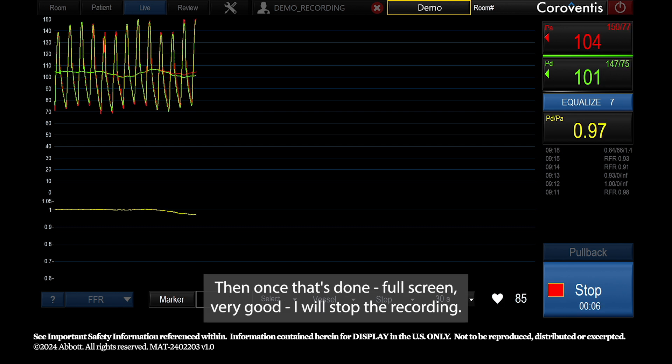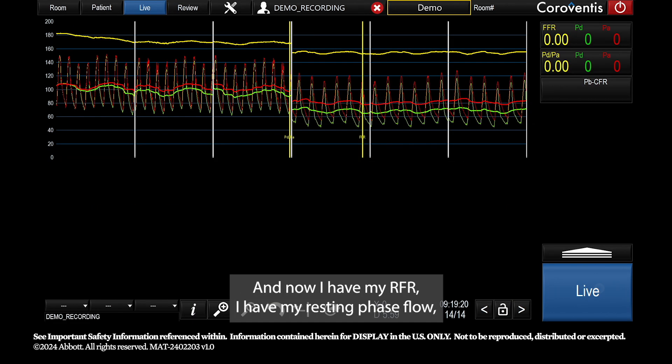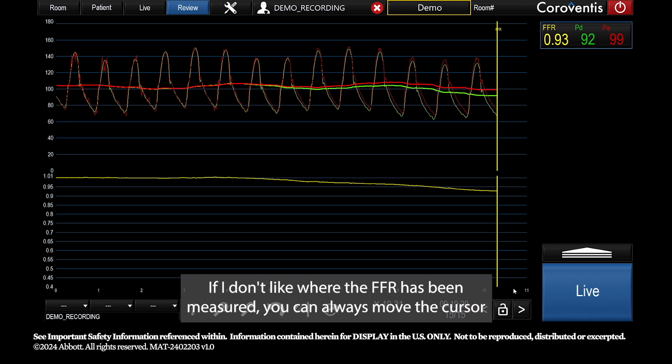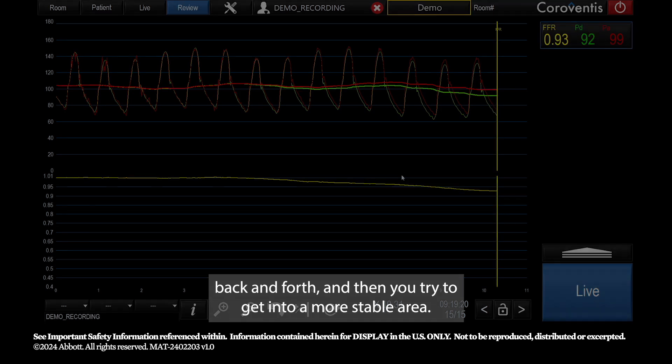Once that's done — full screen, very good — I stop the recording. Now I have my RFR, my resting phase flow, my hyperemic phase flow, and a clean FFR. If you don't like where the FFR was measured, you can always move the cursor back and forth to find a more stable area.